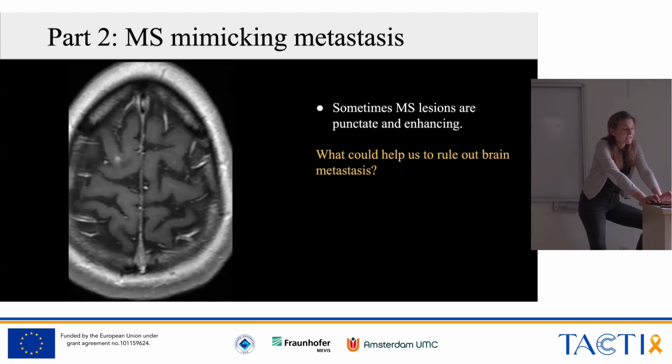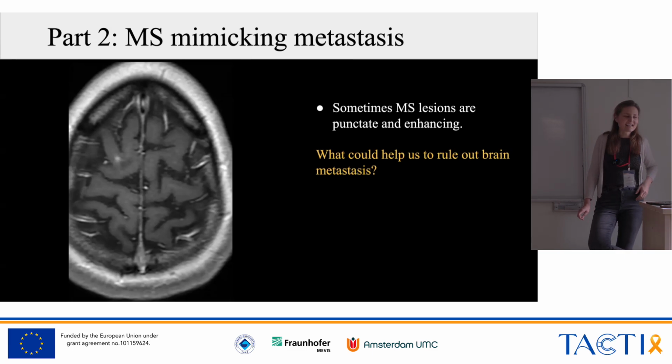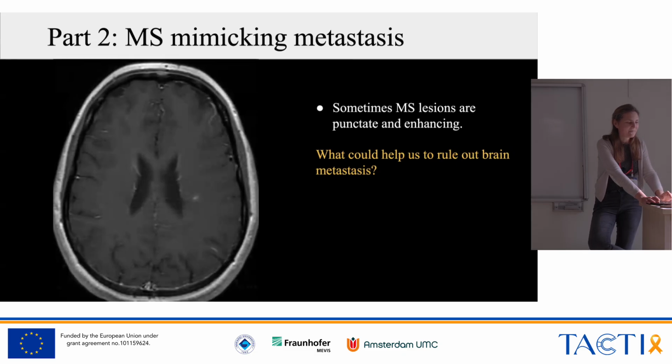So how about MS mimicking metastases? In this case, we handed in for computer-assisted analysis software that we may want to buy. And my colleague says, why didn't you hand in any MS case? And I said, I did hand in one MS case. It's this case. No, this is a metastasis case, they told me. And I said, no, I already put it into my lecture for today for Istanbul. So believe me, it's an MS case. So sometimes MS lesions can look nasty, like brain metastases, that are punctate and enhancing.